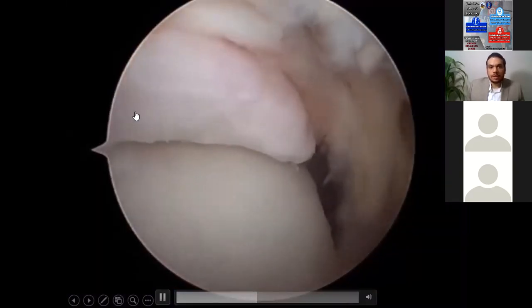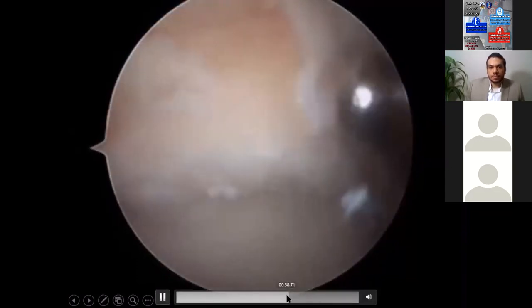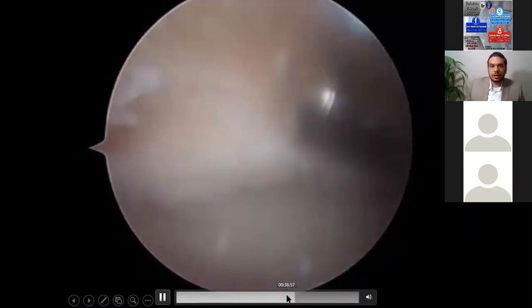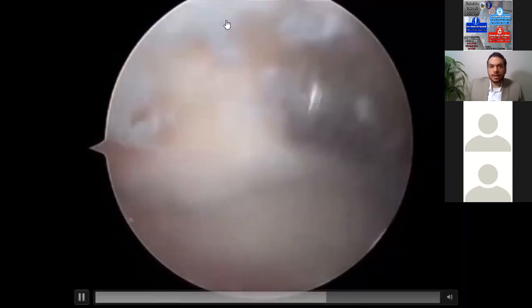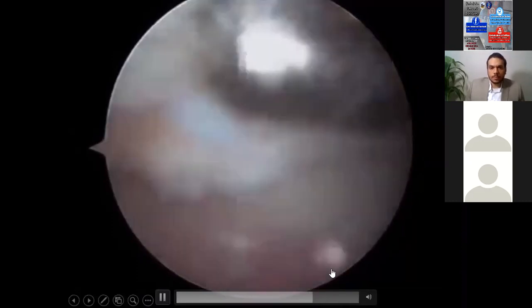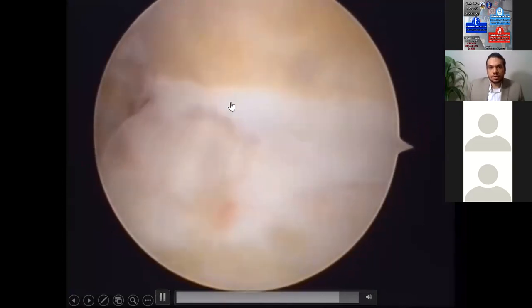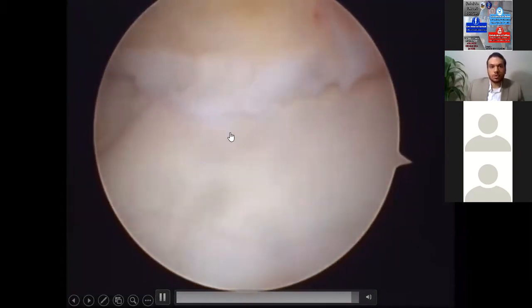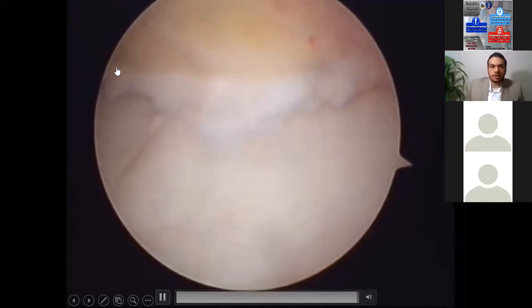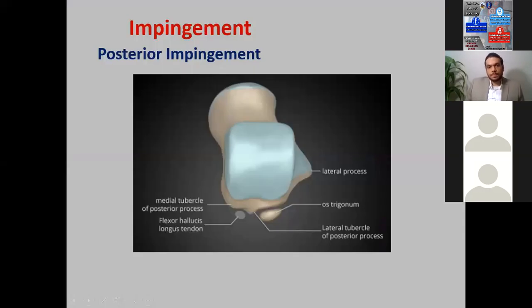This is the anterior tibial plafond osteophyte. It's also resected gradually from the proximal capsular attachment to the level of the joint line until complete resection is achieved. Here is after full resection, and we can see the classic kissing lesions that can occur on the talar dome as a result of repetitive friction with the tibial plafond osteophytes.